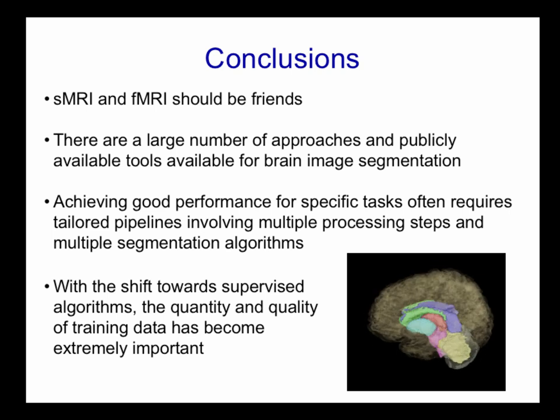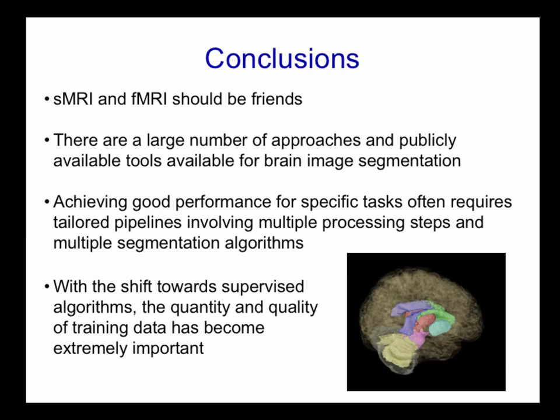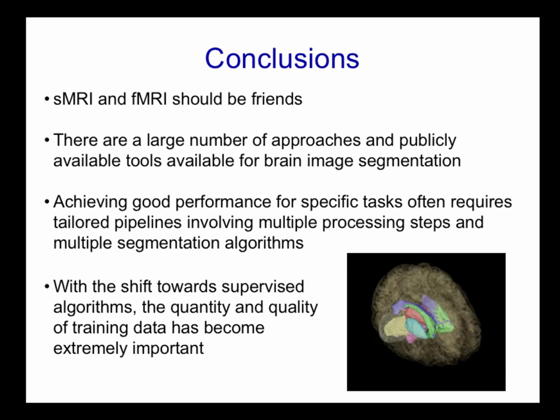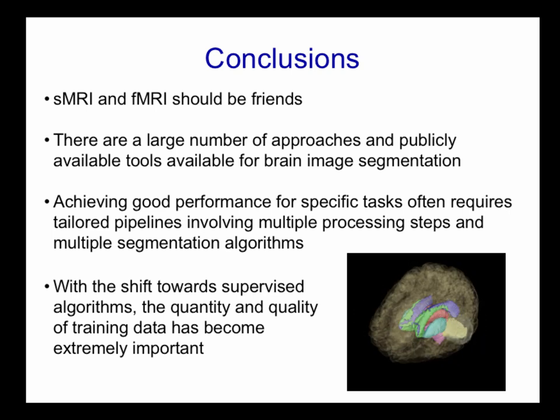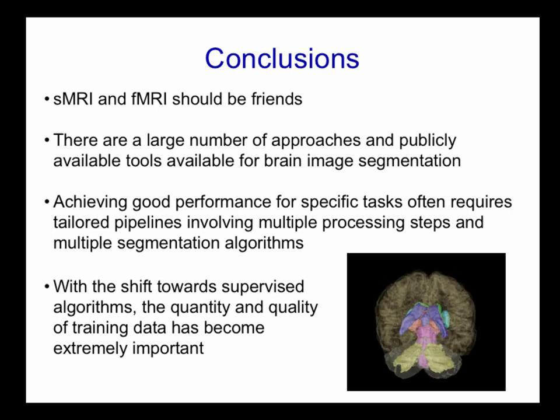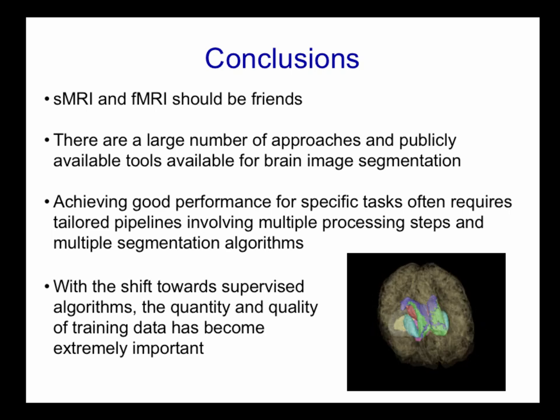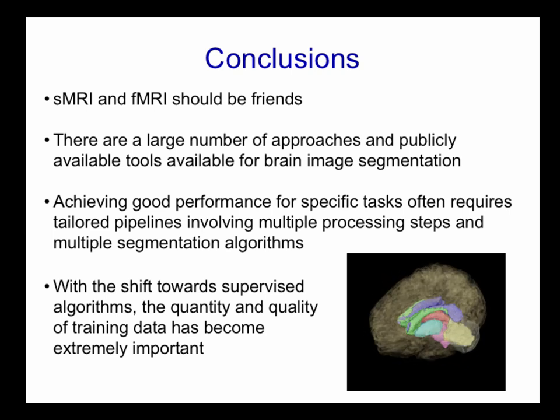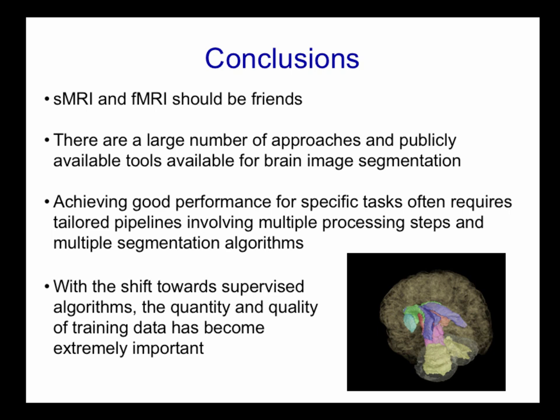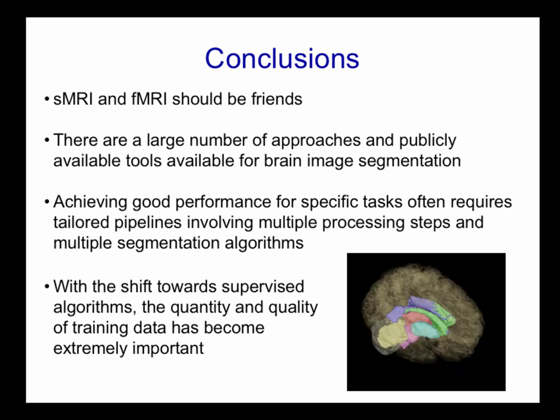These were the free ones that were available from the Vanderbilt challenge. They're healthy brains, random people. I don't know what the exact exclusion and inclusion criteria were, but they were free for the picking, so that's what we used in this case. If you get the training data for Neuromorphometrics, they also have ADNI data that's hand segmented as well.